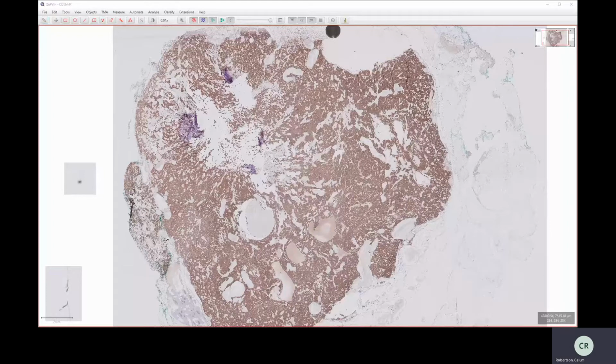So we might use it in the context of malignancy of unknown origin, where we've got a malignancy that's turned up, it's been biopsied, we know it's a metastasis, but we don't know where it came from. We can look at that and see on H&E, where does it look like it came from? Does it still resemble some sort of tissue? And we might narrow down our IHC panel based on that.